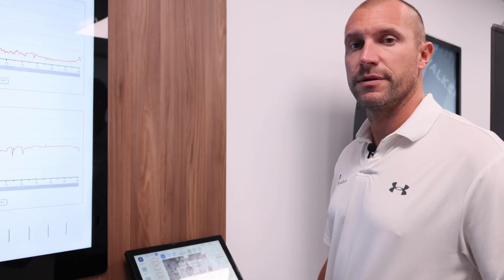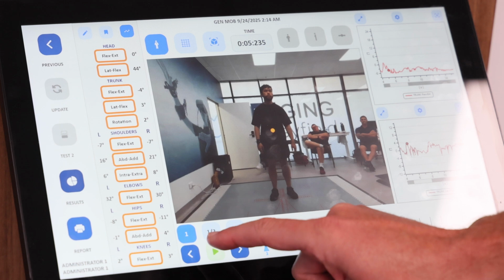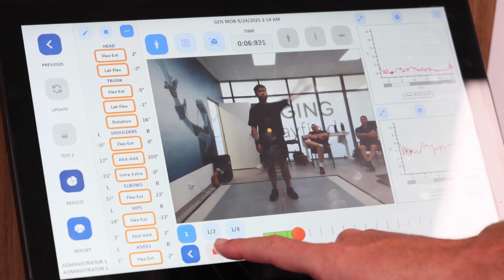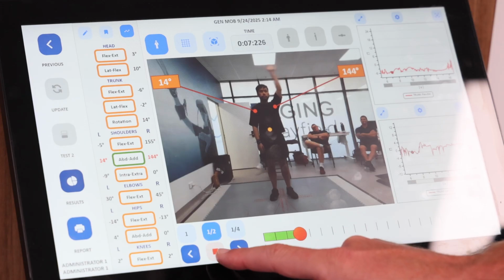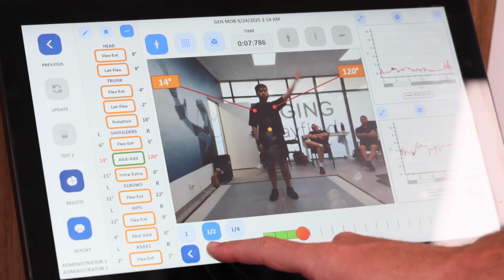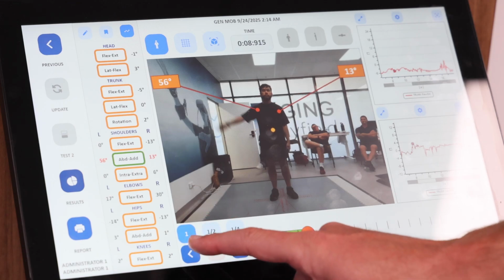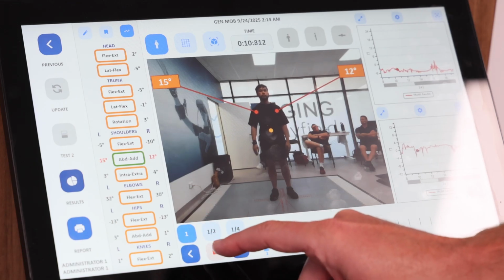Once you complete the motion analysis assessment, the software will display the video that you recorded. Inside the video it's possible to check all the range of motion for the head, trunk, shoulders, hips and knees. The software offers even the possibility to rewatch all the graphics, so to analyze frame by frame all kinds of movements.